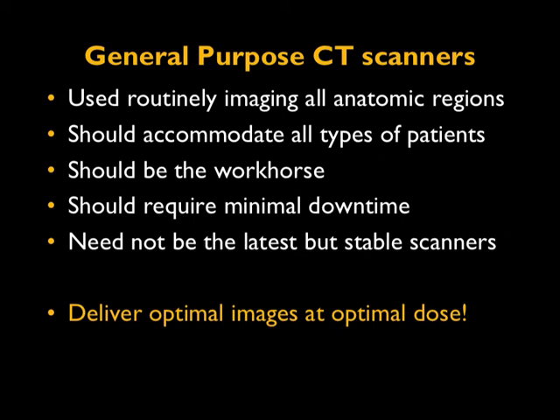Second, the scanner should accommodate all types of patients, whether a pediatric patient, an elderly patient, or an extremely obese patient and so forth, because the general purpose CT scanner is the go-to scanner in the hospital or clinic.